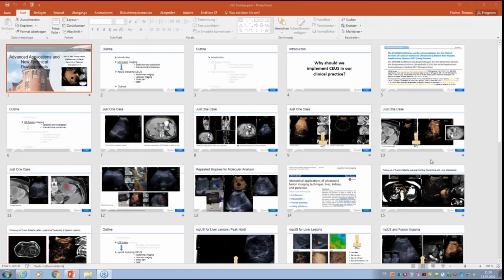Yes, and also if you're the patient, it's much better and more comfortable and reassuring if the practitioner is with you the whole time, instead of everyone shuffling out of the room and repeating the CT. And this is particularly true, of course, in the younger patients and the children in particular, if you're doing procedures on them.